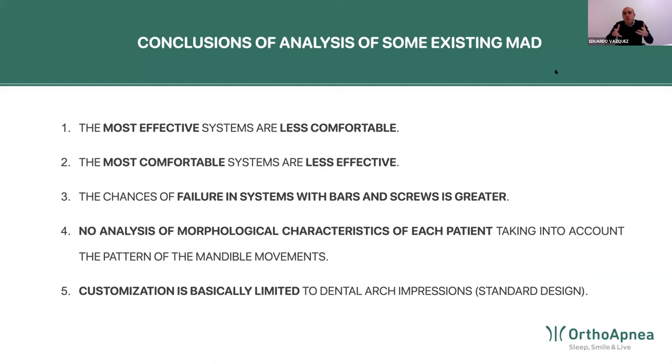Sometimes we saw that the systems that had bars or screws to regulate the degree of protrusion had more chances of failure because of misalignments or breakages, for example, where the insertions of the bars were or where the screws were inserted into the splints of the MAD. None of the devices really had a customization to the mandibular kinematics of the patient. So basically the degree of customization was this regulation of the mandibular protrusion and the adaptation to the dental arches of the patient. And obviously this was, for us, clearly insufficient.